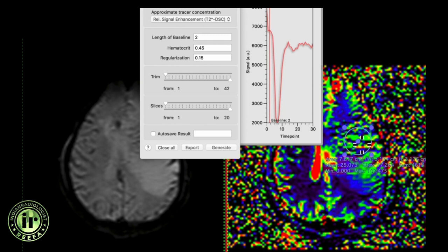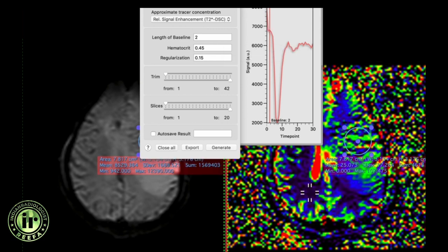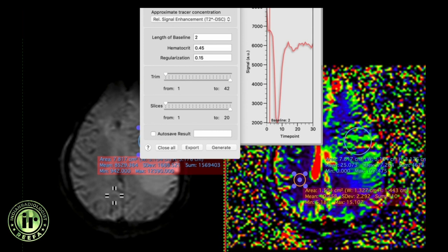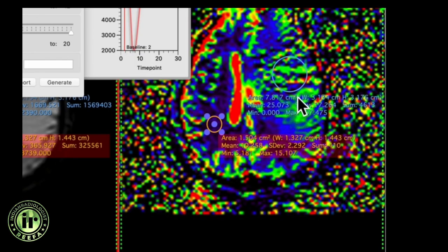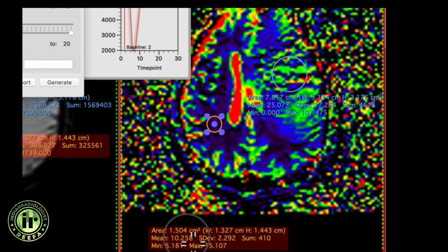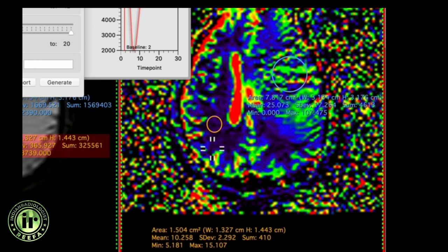Copy this ROI (Command-C) to the native perfusion image (Command-V). Similarly, draw an ROI in the contralateral unaffected white matter and copy it to the native perfusion image. You can then get various measurements. Here the mean measurement in the region of tumor is approximately 25, compared to the contralateral ROI showing approximately 10, giving an rCBV of the tumor versus normal contralateral white matter of approximately 2.5.